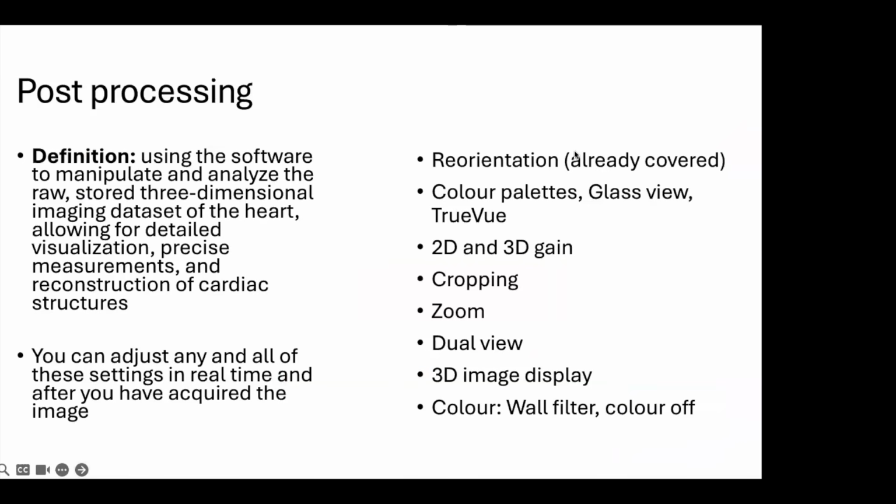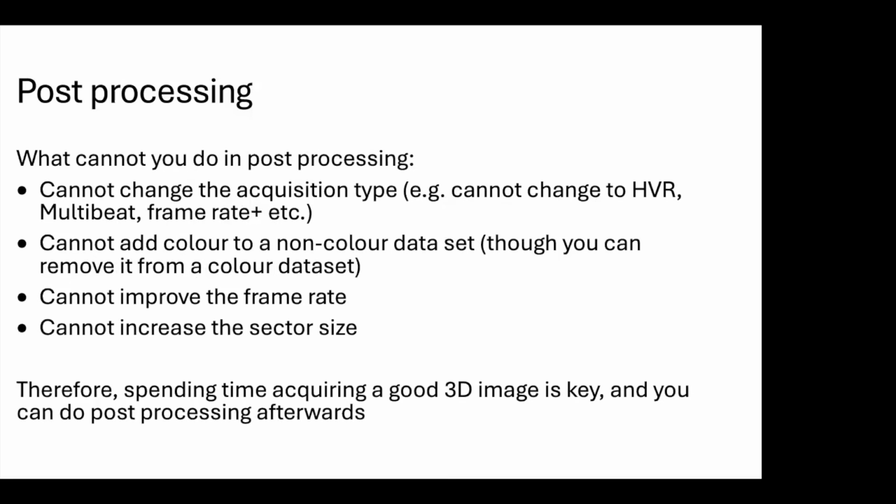For the remainder of the talk, we'll talk about post-processing. And so this is using aspects of the software to manipulate and analyze the 3D data set. While it's called post-processing, all of these things you can do live. And in fact, I encourage you to experiment with this live, but these points mentioned here, you can do after the image is acquired, once the patient is gone, for example.